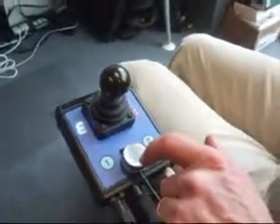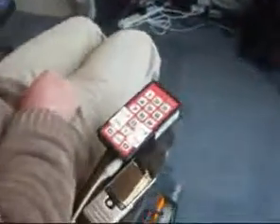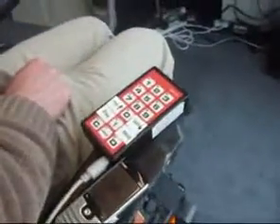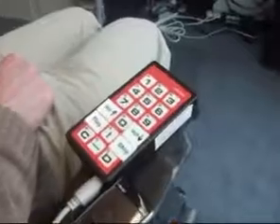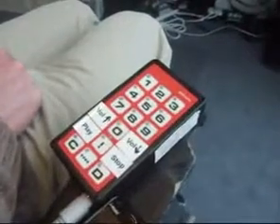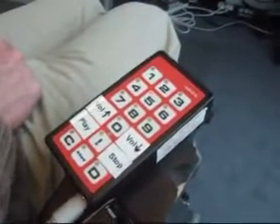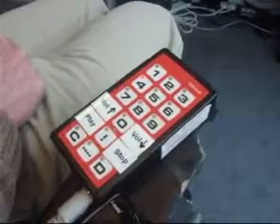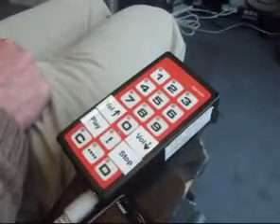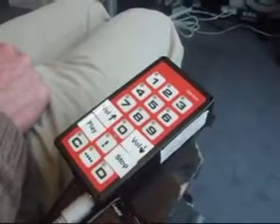Pressing the switch will emulate a left click, which sends the character to the word processor. If necessary, the right click can be emulated with another switch. The switch is pressed again, and external access is selected.